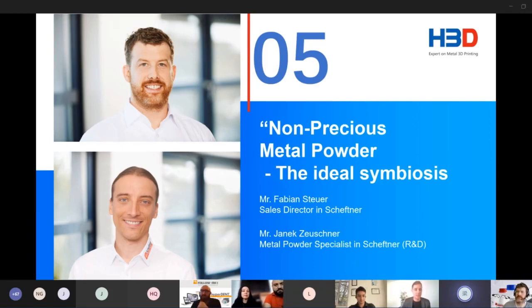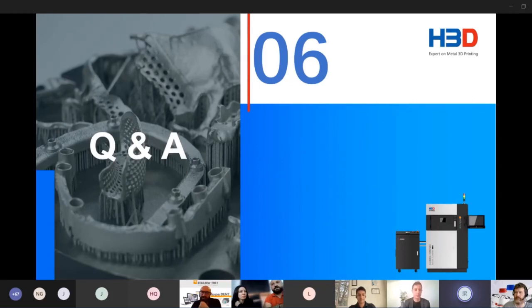This is the sinterization, obviously. The wrong heating in the oven during the sinterization of the ceramic. Yeah, it's obvious. The temperature is too high. So please find the correct temperature to sinterize your frames. Even if the metal part is sintered well, if you put a ceramic on, you should bake it. And this heating can affect it significantly.